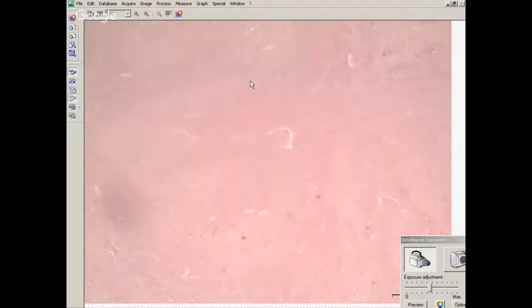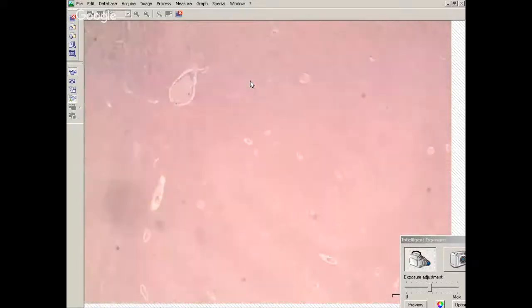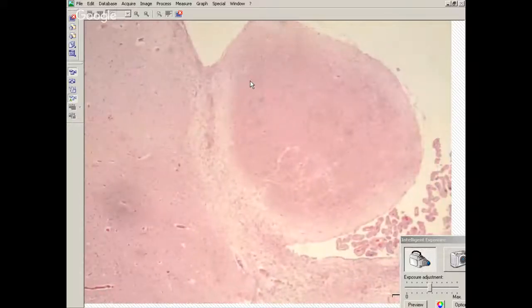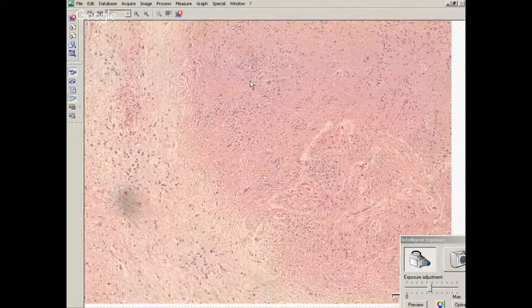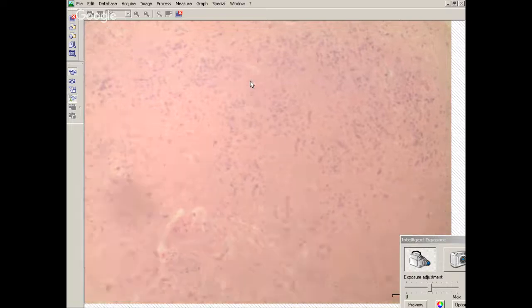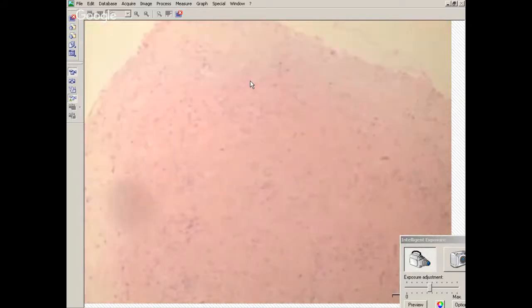And this is the medulla. So here's the olivary nucleus, the pyramids. And attached at the back of the fourth ventricle, here's choroid plexus, and attached at the back of the ventricle is this heterotopia. And this is a subependymal nodule. So burn this image into your brain, because I'm going to now show you a tumor.